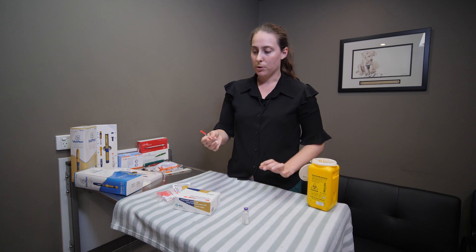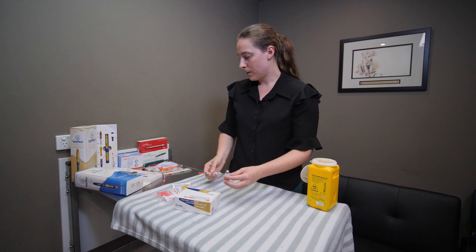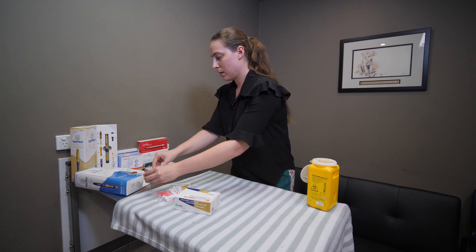After administering the insulin to your dog, your vet may have provided you with a sharps container. Otherwise, if you carefully recap your needles, you can generally dispose of them at your chemist or at your local vet clinic. Then pop your insulin back in the fridge.